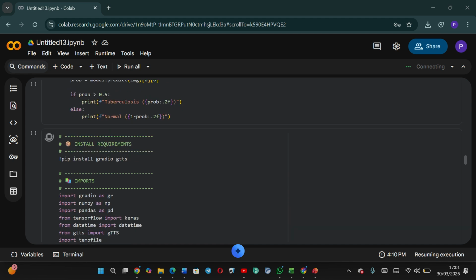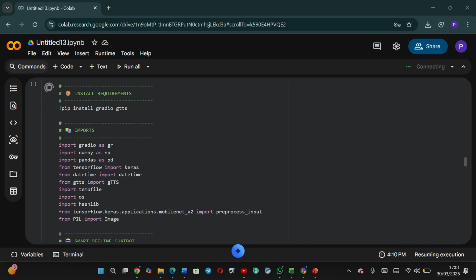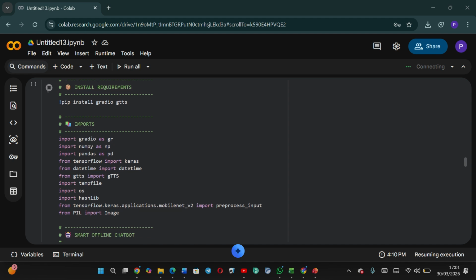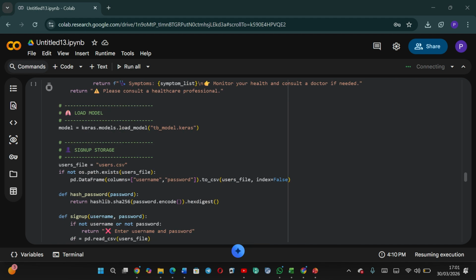Our final code is the Gradio interface. We built a user interface using Gradio. We installed Gradio and gTTS for voice output. The app allows users to upload an X-ray image. The model predicts the results and optionally gives audio feedback. This makes the system interactive and user friendly. So this is our interface.